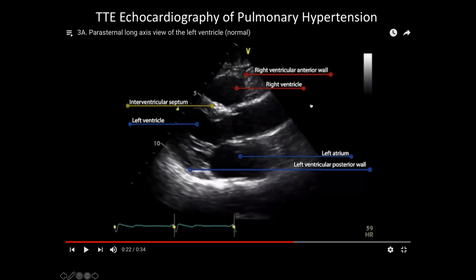You get a very high resolution CT, from the patient's groin all the way up, because you want to see the pathway for the catheter. Then you size exactly the root of the aorta, that of the valve that's going to go in. And then it's basically done under fluoro and TEE, and they position it and then open the valve.